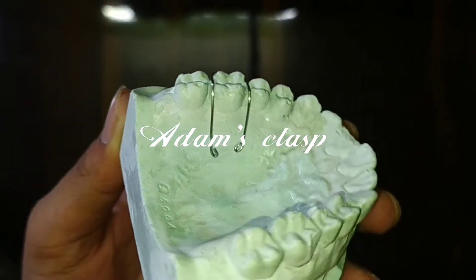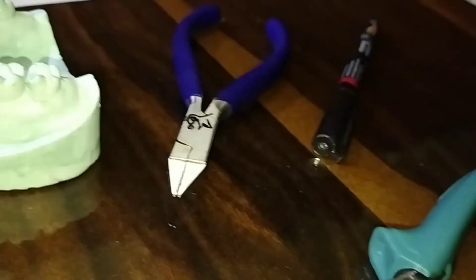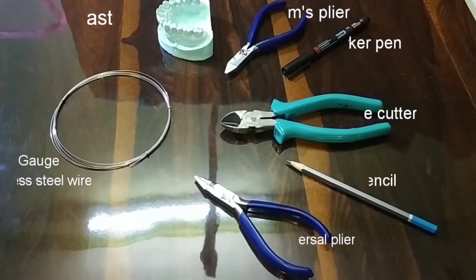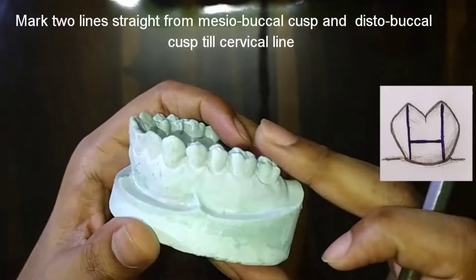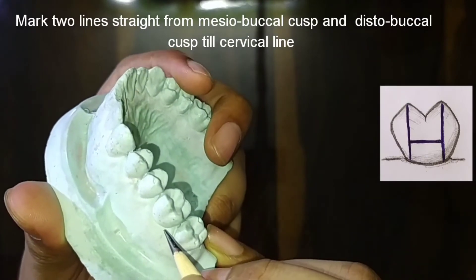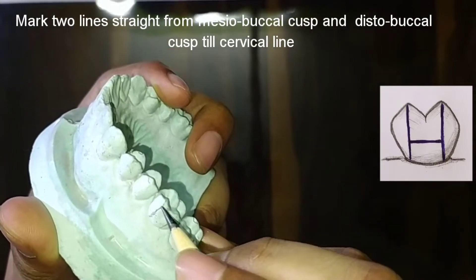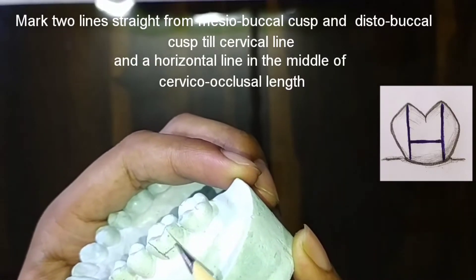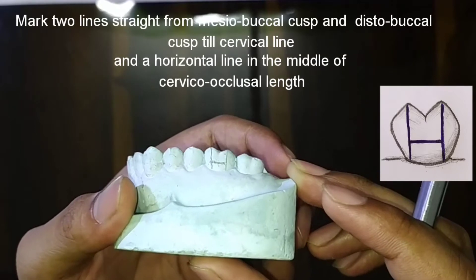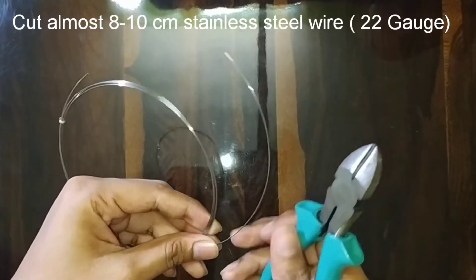Hello everyone, welcome to my new channel. This time we are going to make the Adams clasp, which is used in orthodontic treatment. First of all, we'll mark two lines from the meso-buccal cusp and disto-buccal cusp vertically downwards, and a horizontal line in the exact middle of the crown as shown.